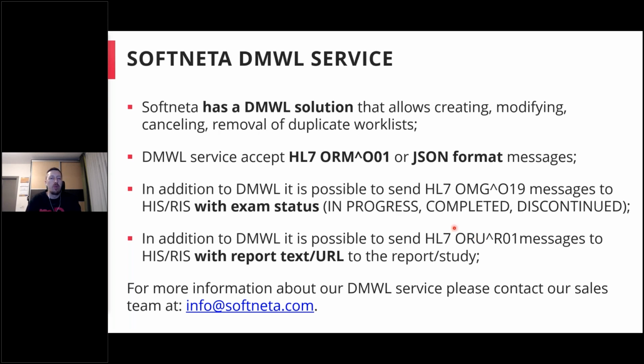Also, it is possible to send some report text, or the link, or the accession number, study UID, or whatever is needed by your HIS system to notify you that the exam is already here. So if you need such a service, or want to ask about it, contact our sales team, and they will provide you all the information needed about this service.